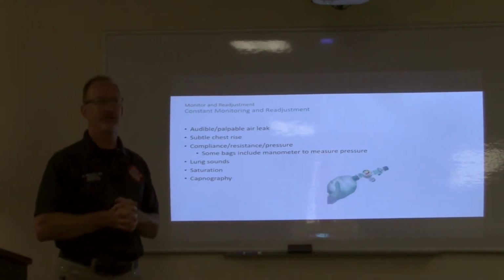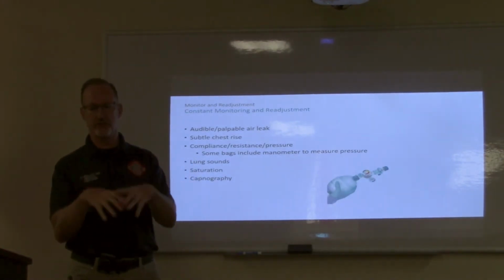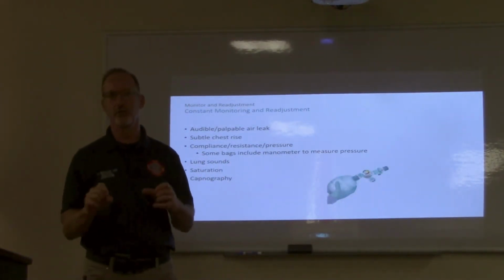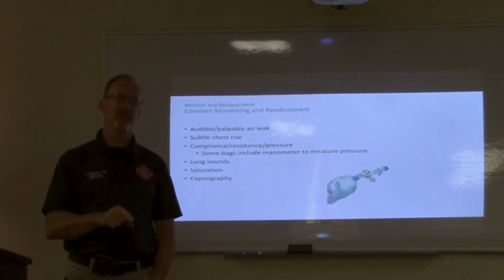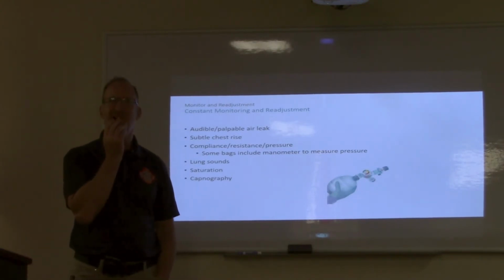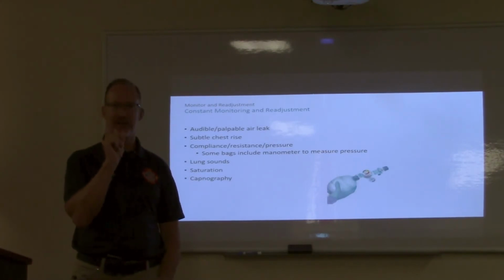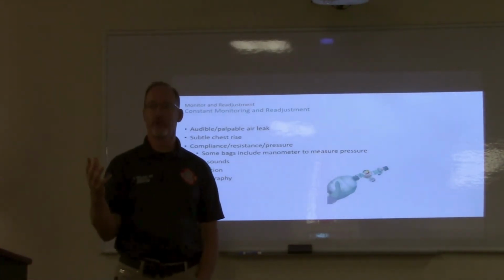Do you think we could assess if I'm trying not to overventilate a patient so that I don't see this big chest rise like we were all taught in school, right? Do you think I can assess how well I'm sealing the mask with capnography? How would I do that? Waveform. Okay? You need the waveform. Can't look at the number, now you need the waveform. Same way to look at pathophysiology like obstruction and reactive airways disease, you need to look at the waveform.